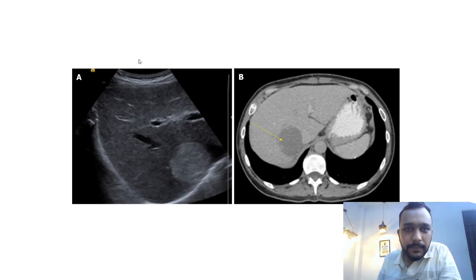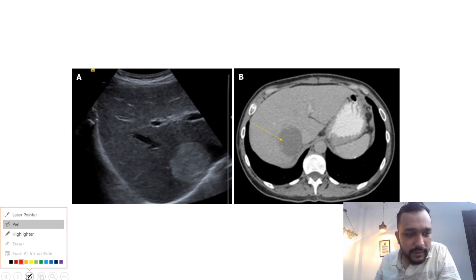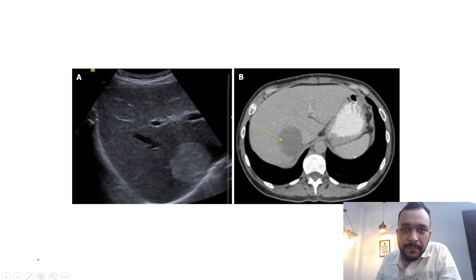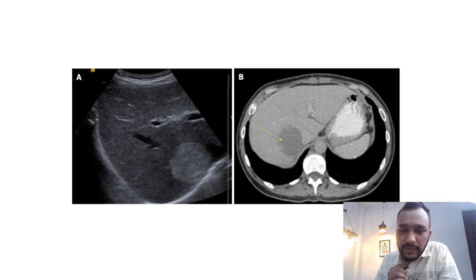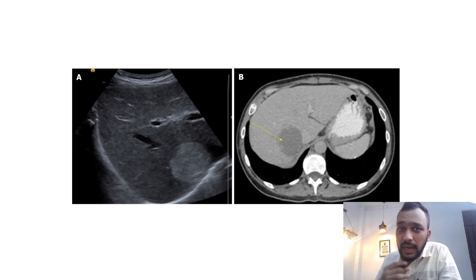I hope you guys have seen the previous two videos in which I discussed what is triple phase CT abdomen and what is the normal CT anatomy of the abdomen. In this short video I am going to show you a few important pathologies which are going to show arterial phase hyper-enhancement.